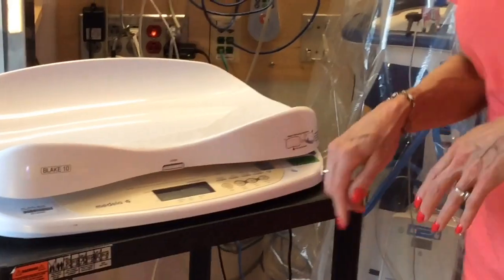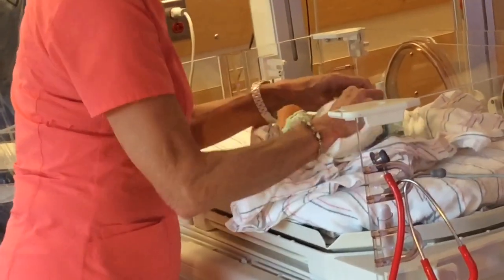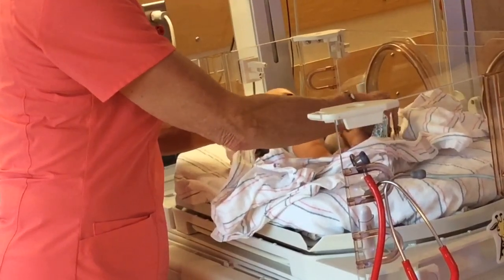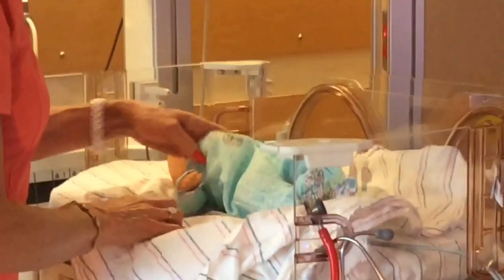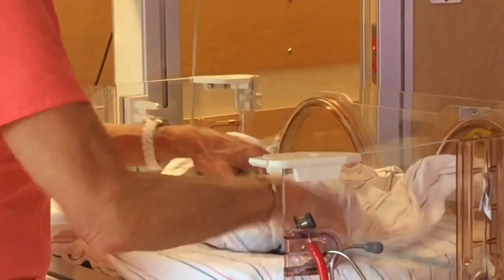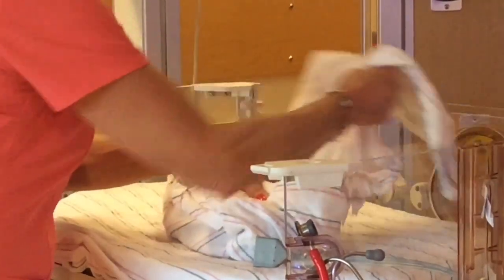But if you keep them all the way screwed up into the scale, you will have a level scale. Then you're going to change the baby's diaper. The baby starts with a clean diaper. You can leave clothes on or whatever — whatever the baby has on before the feed is what the baby has on after the feed. Change the diaper. You're going to swaddle the infant so there's fabric behind the head, and the swaddling prevents a lot of excess motion from the baby. You swaddle, you remove the leads, and you disconnect from the SAT monitor and the EKG.